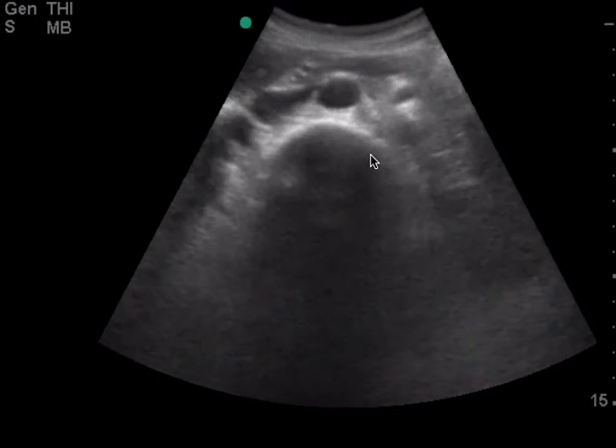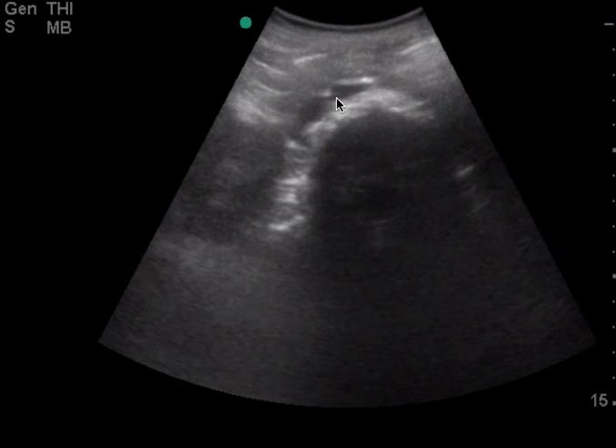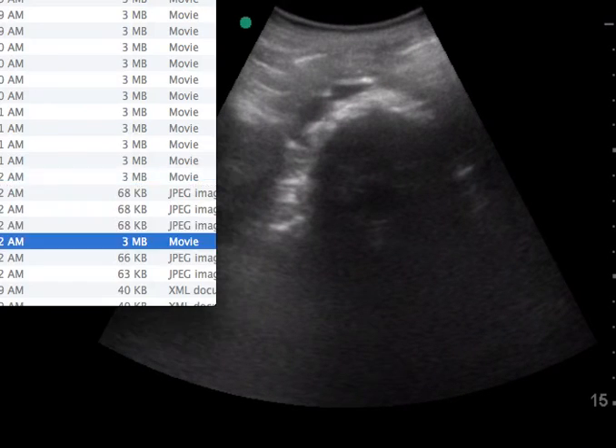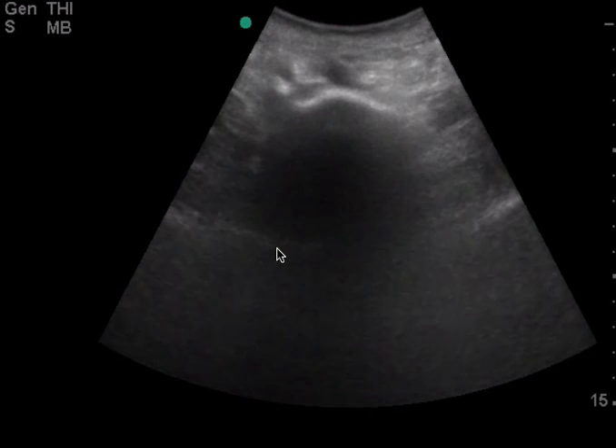Another view here as you're going down, following it down as it begins to bifurcate. And I think you have the bifurcation right here.